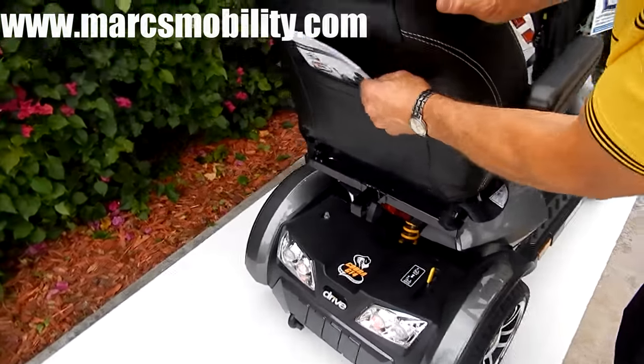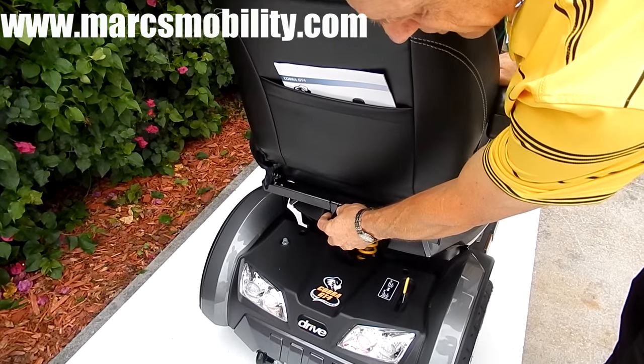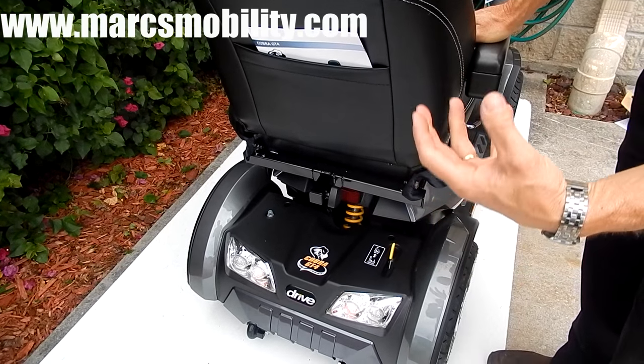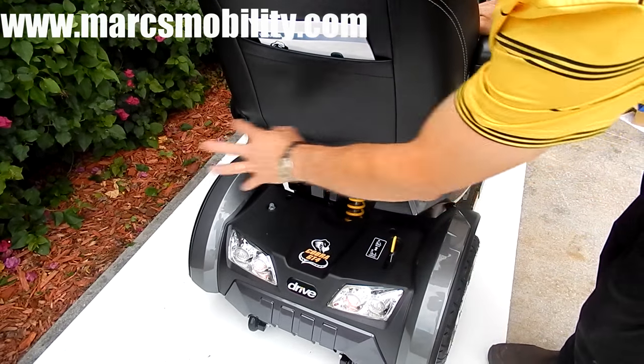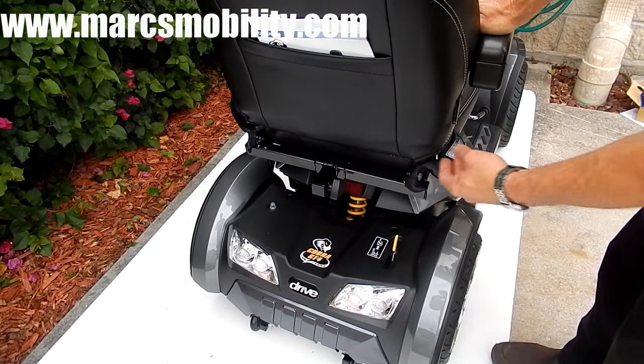In the back of the seat, you've got your owner's manual and a little pouch. You've also got a docking device here, because with this scooter you can almost pull a small trailer if you need to put grocery bags, or you can have a basket back here — they do have little trailers that you can pull for these scooters.